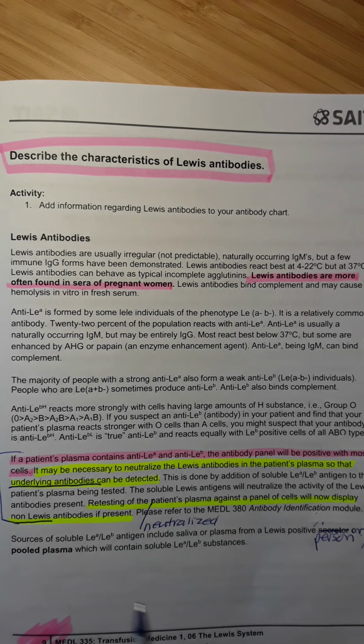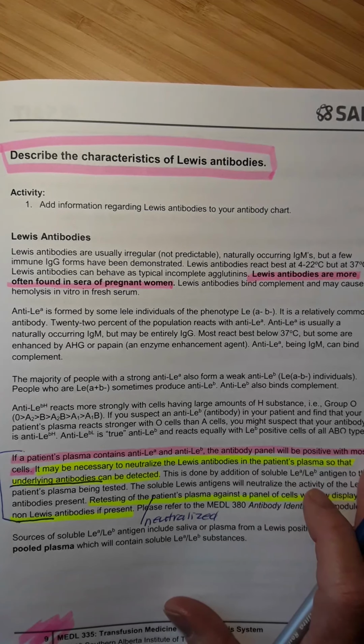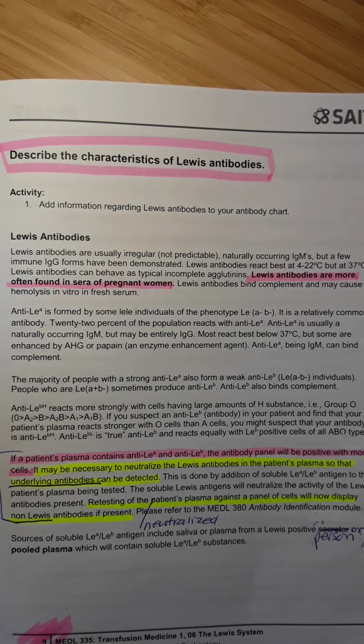Hi there, everybody. I wanted to take a few minutes to talk about the Lewis neutralization panel.